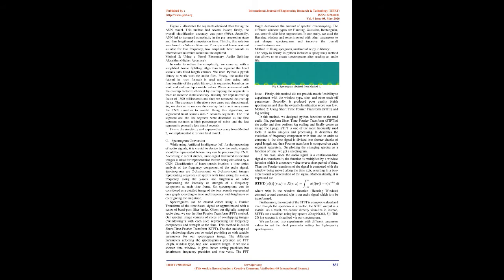Method 2, using a novel elementary audio splitting algorithm, higher accuracy. In order to reduce the complexity, we came up with a simplified audio splitting algorithm to segment the heart sounds into fixed-length chunks. We used Python's PyDub library to work with the audio files. Firstly, the audio file, stored in .wav format, is read and then using the split functionality of the PyDub library, it is segmented based on the start, end, and overlap variable values.